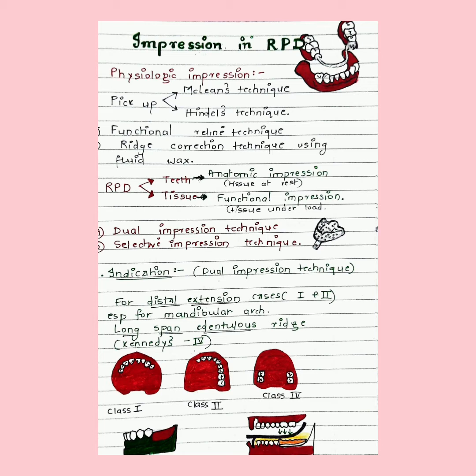Well, let's get this straight. Why do we need different impression techniques in RPD? Why can't this be as simple as CD? In RPD cases, we have tissue and teeth, and thus the force distribution is different. Also, because of the property of resiliency of mucosa, we have resilient and non-resilient areas.